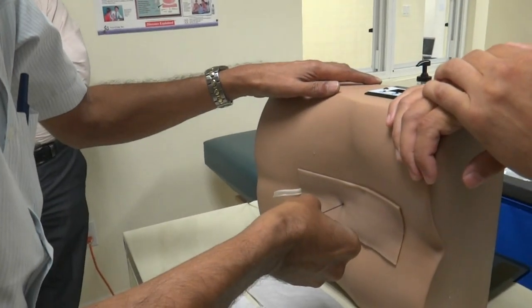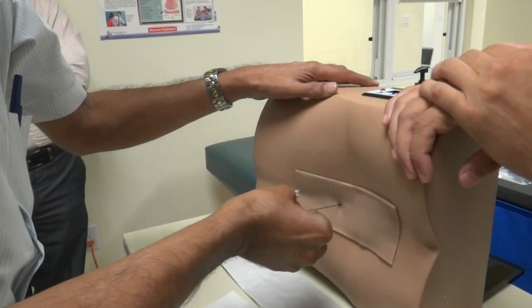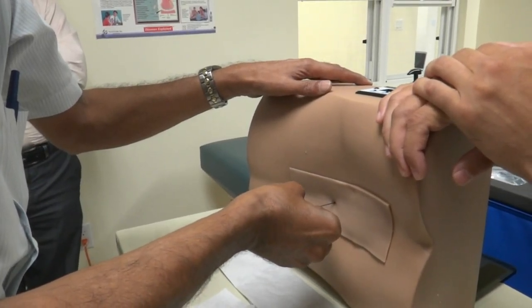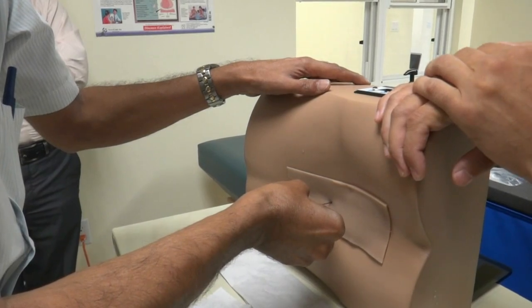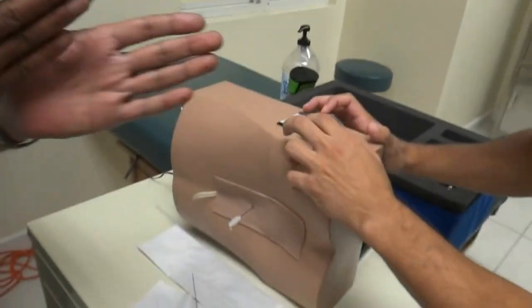Look at the precision. He got it! First try! I did it! I did it!